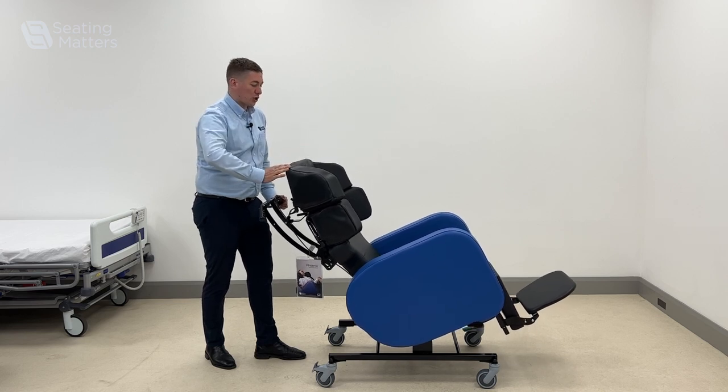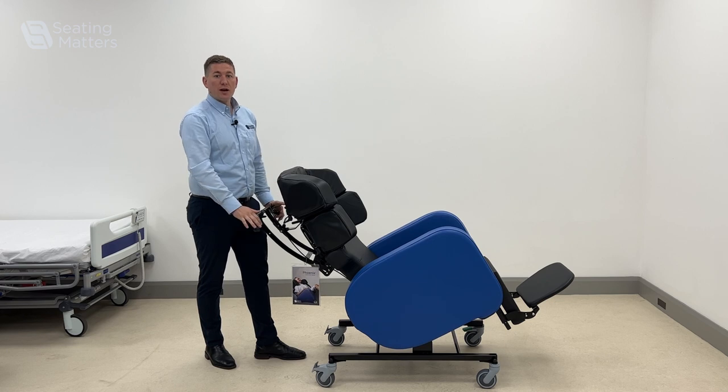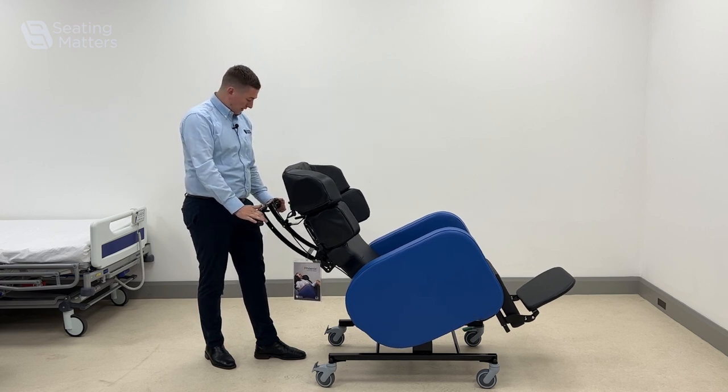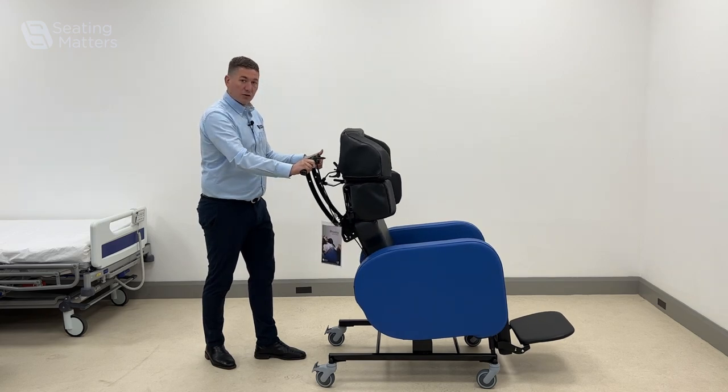If they've got a kyphotic posture, it allows them to see around the room better, increasing their vision. So just the two levers on the back — one for your tilt and one for your back angle recline.